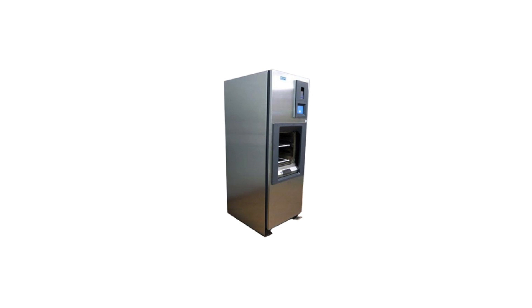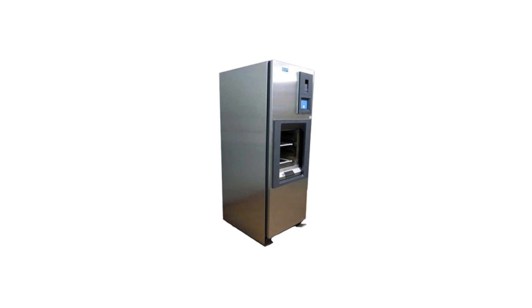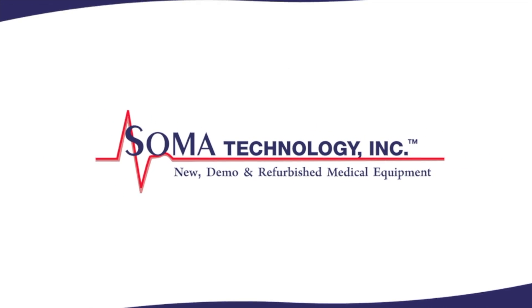The Steris V116 sterilizer is designed for fast, efficient sterilization of heat and water resistant materials with the same capabilities as a gravity sterilizer. To view more information about the Steris AMSCO Sentry V116 or other products, please visit somatechnology.com.